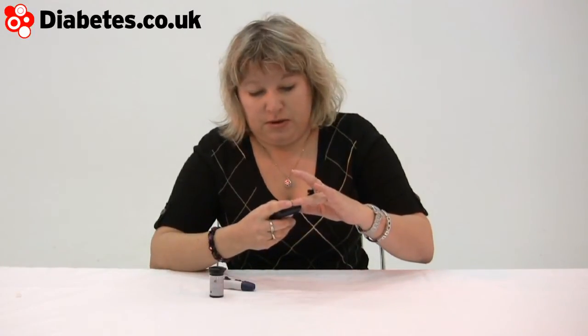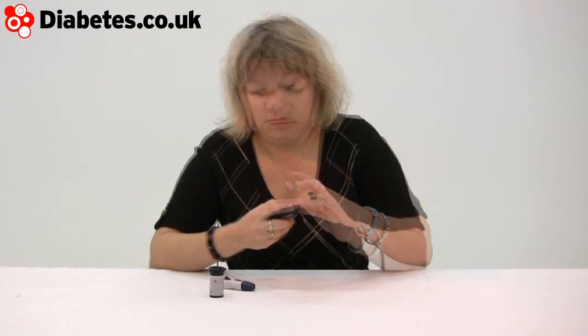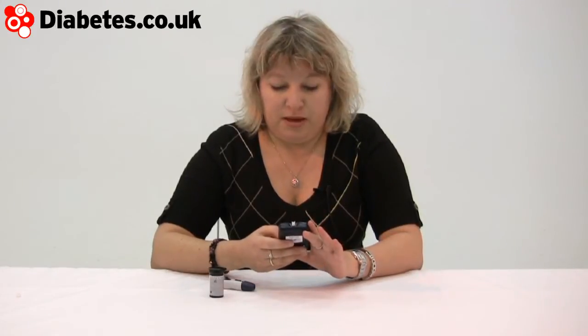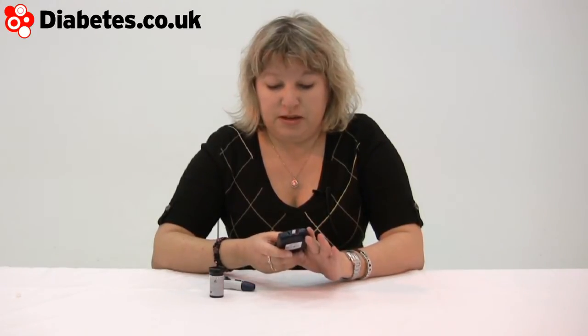It tells you to apply the sample. That's going to count down just now. 9.6, going up. And it questions you whether or not it's after a meal.